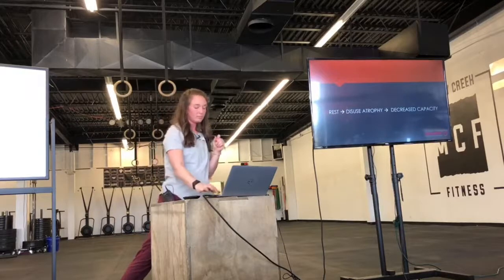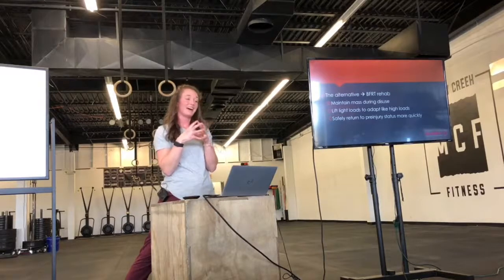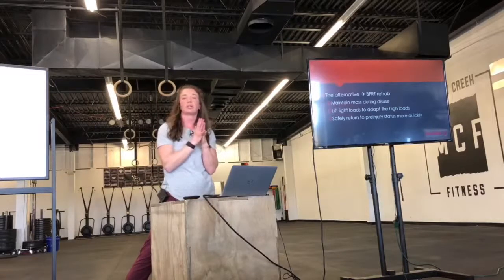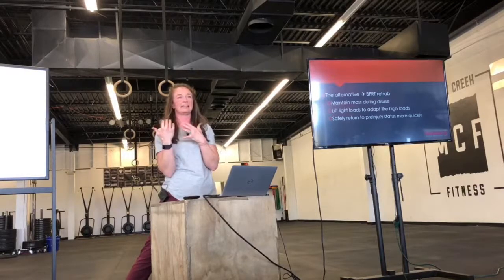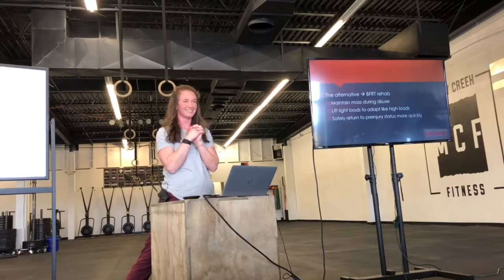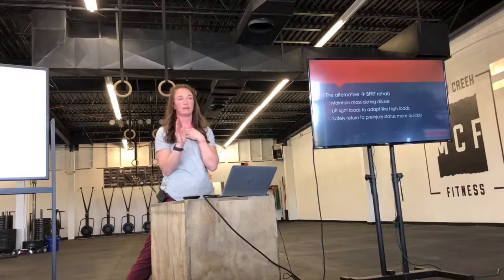So this is where blood flow restriction has really made a play in the rehab setting, okay? So we can now utilize blood flow restriction training to still get stronger while working under less of a load. Does that make sense? I wanted to just kind of go through that because that is ultimately how blood flow restriction training works. So we're gonna demonstrate this tonight on Brooklyn. Brooklyn has volunteered. She's never had blood flow restriction training done before, so she's not gonna be biased or kind of know what to expect, which is gonna be great.